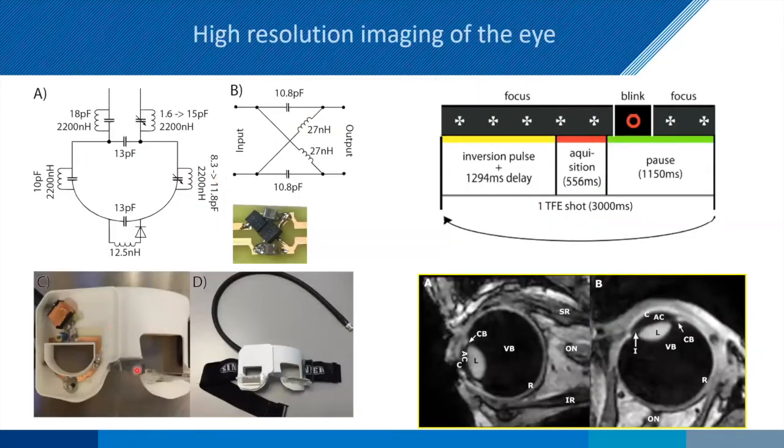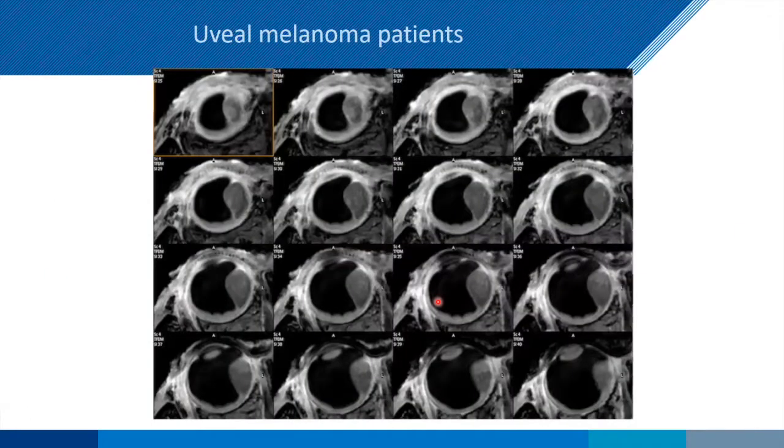you build your own coil, right? So you have to, again, go through all the safety checks, things like this. So here's an eye coil over here. We're going to have to scan for a couple of minutes, which means the patient's going to blink. We can't afford to have any motion there because we're going to be looking at small tumor volumes. So we have what's called a cued blink protocol. So we acquire part of k-space, then the patient blinks, then we go ahead and continue. And so this is all work done by Jan Willem Beenakker in our group.